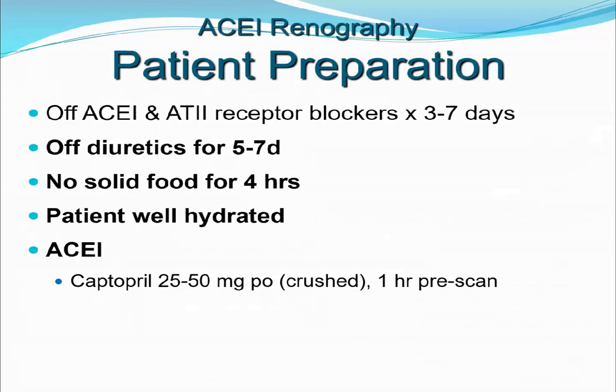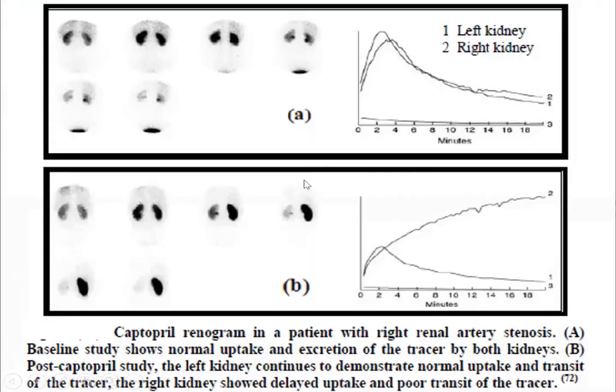The dose is 25 to 50 milligrams orally 1 hour before the scan. This is an example.